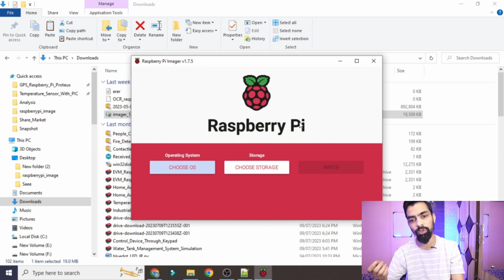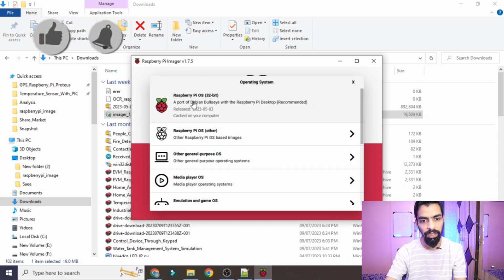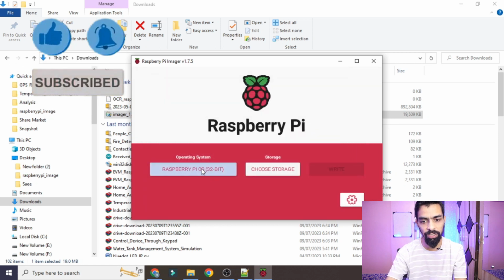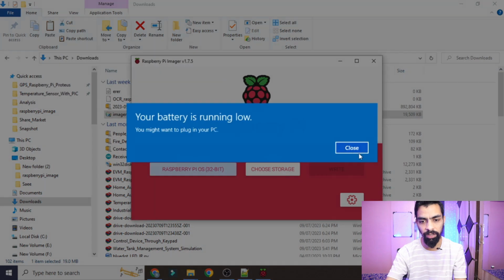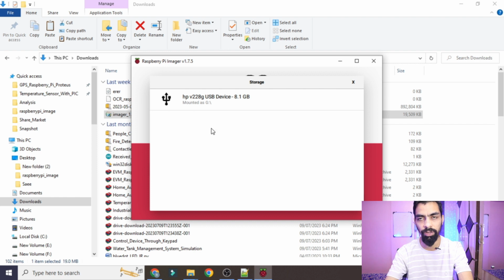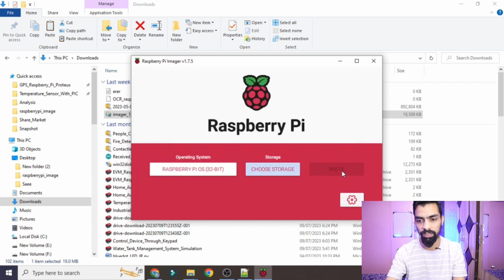You have to take your 32 GB or whatever GB memory card into your card reader, and then connect that card reader to your laptop. After you connect it, click on Choose OS and select the recommended 32-bit OS. Then click on Choose Storage and select your card reader path. Then click on the Write button.